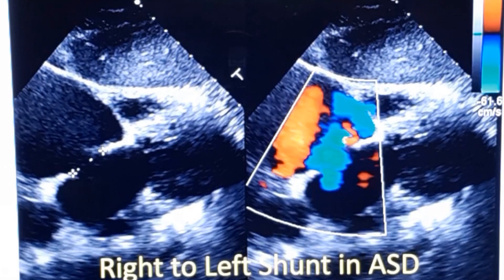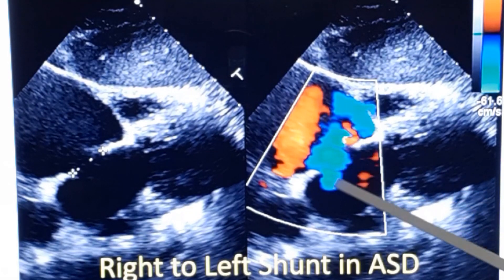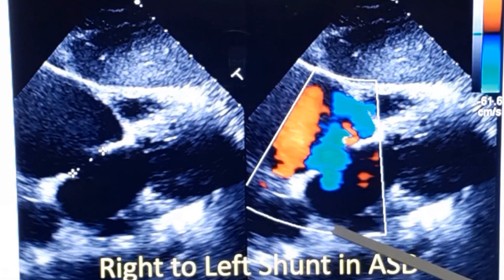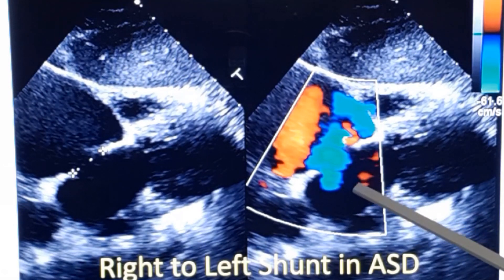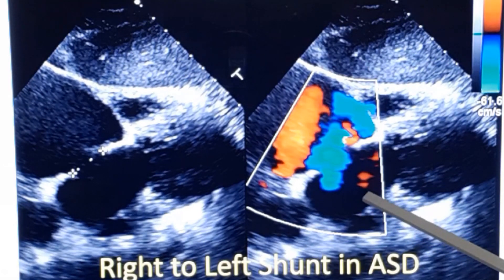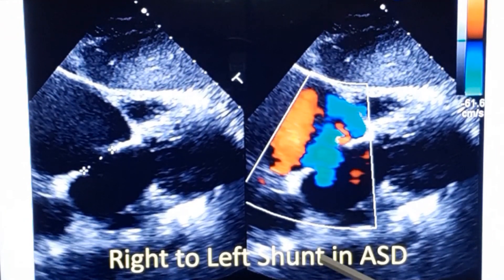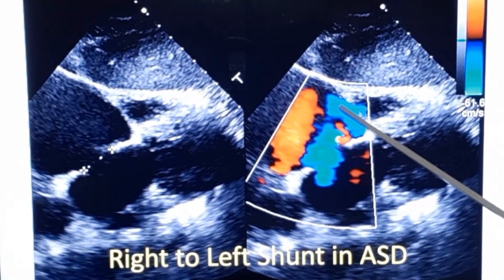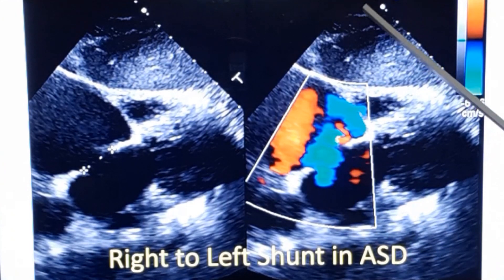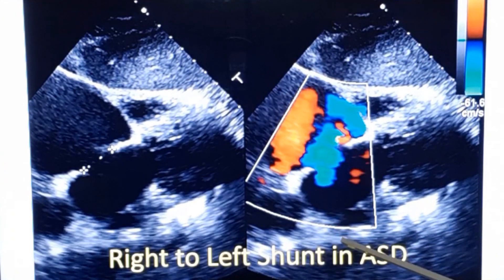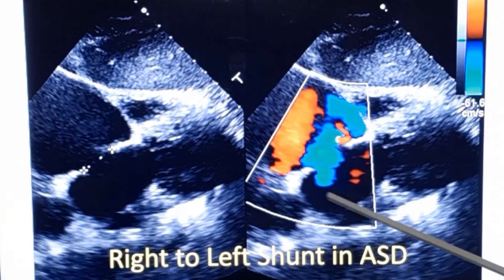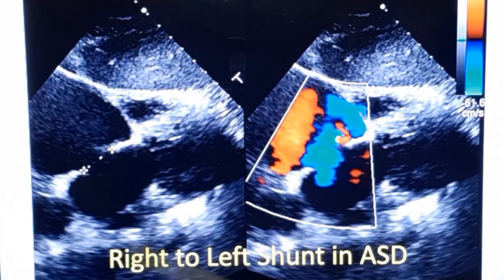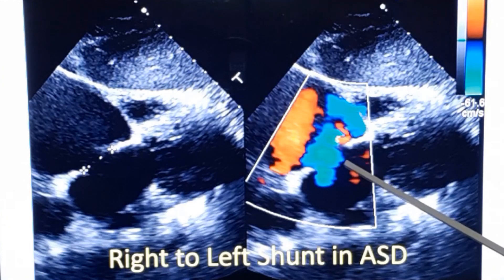In this image you are seeing reversal of flow across the atrial septal defect. Instead of red, the color is blue — it is moving away from the transducer. Doppler echo works by calculating the Doppler shift from moving red blood cells, so if the red blood cells are moving away from the transducer, the color coding will be blue on color Doppler. Side by side, you can see the atrial septal defect.